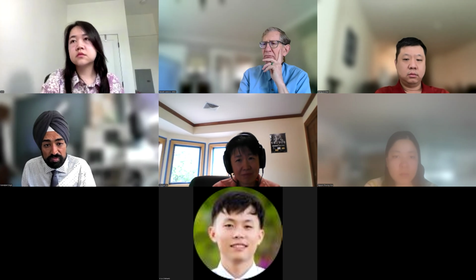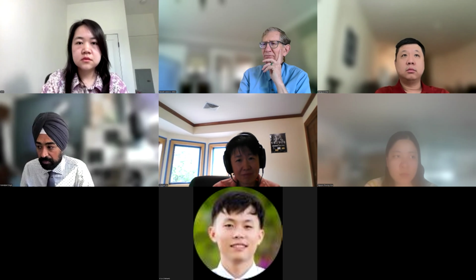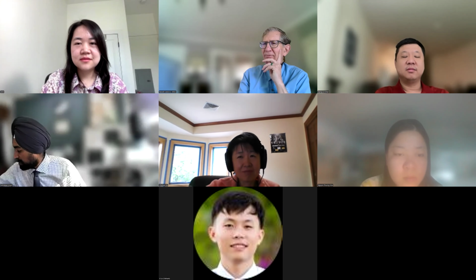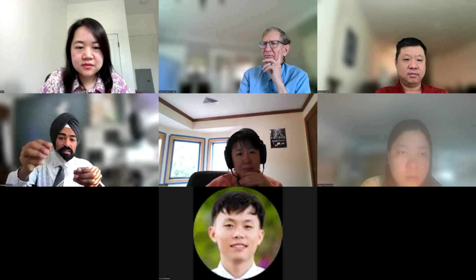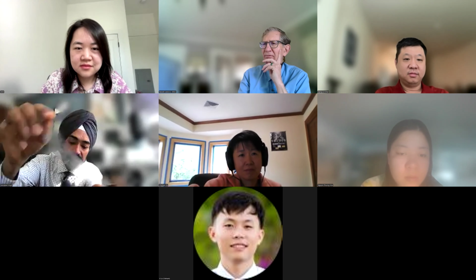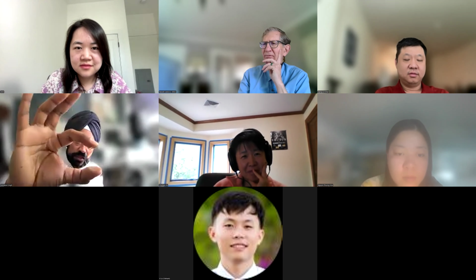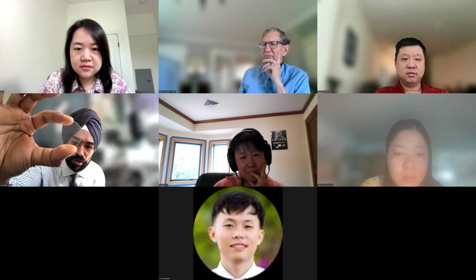Yeah, thank you. This is my first time seeing that ruler on the microscope. Is it transparent? This is transparent, and this one is actually cheap. One of my attendings gave it to me. This other one is more expensive, but it measures up to 0.1 millimeter.